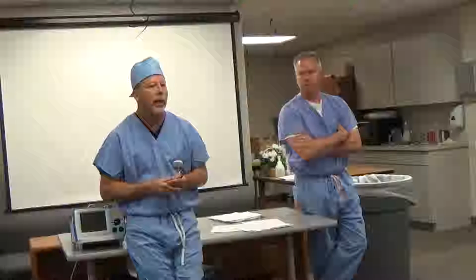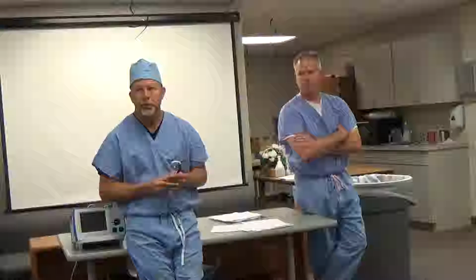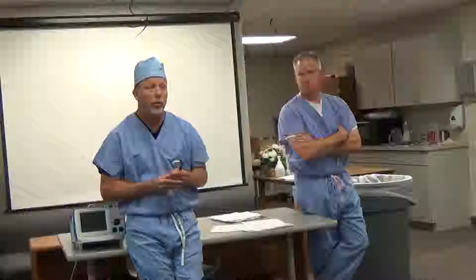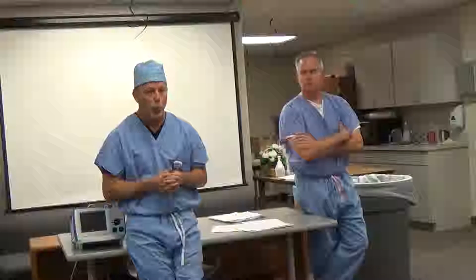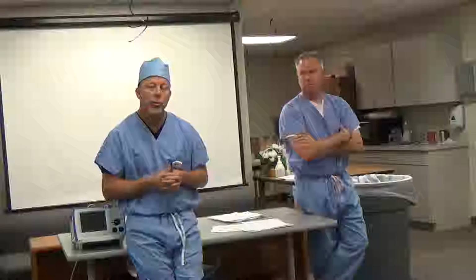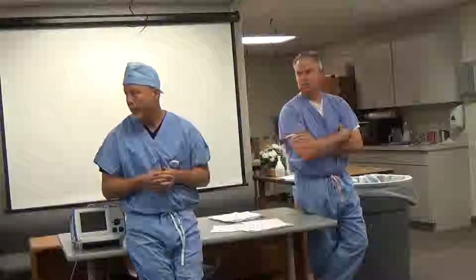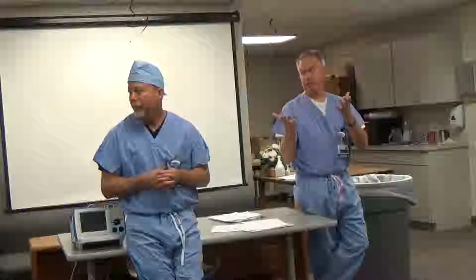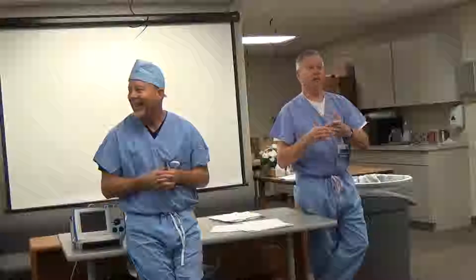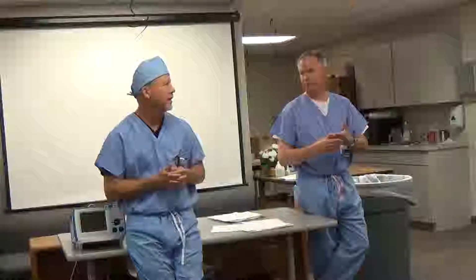Can you defibrillate a child with adult pads? Yes, you sure can. Can you defibrillate an adult with child pads? No. Okay. What is the joules per kilogram for a child? 2 to 4. Yes. And what about the weight? I mean, that's kind of hard. Pull out that stretch thing and say. Yeah, but according to the Zoll, it's 15 kilos. Yes. So 30, 35 pounds.